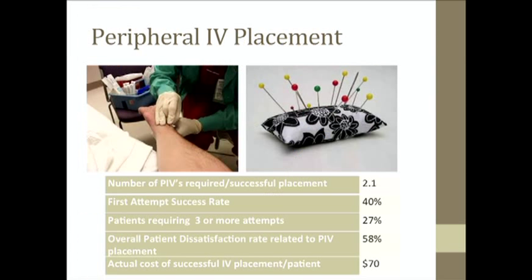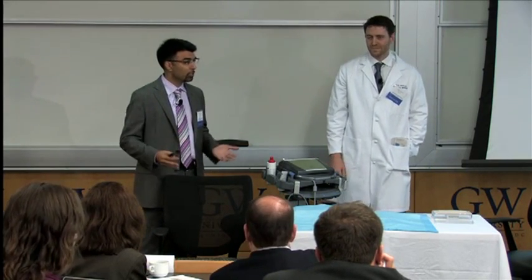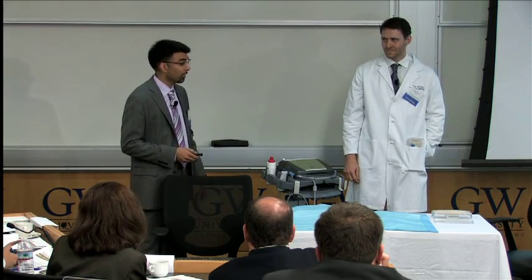So let me tell you a little bit about peripheral IVs and placement. Probably everyone in this room has had an IV, if you've had to get any health care. About 150 million patients in the United States get an IV, and that consumes 500 million catheters. Worldwide, that number is about 1 billion catheters. And catheters are used for all sorts of things. They're used for giving you IV fluids, giving you medications, drawing blood. So there's a variety of reasons that you might get an IV catheter.